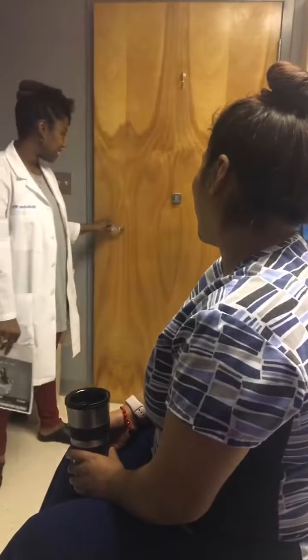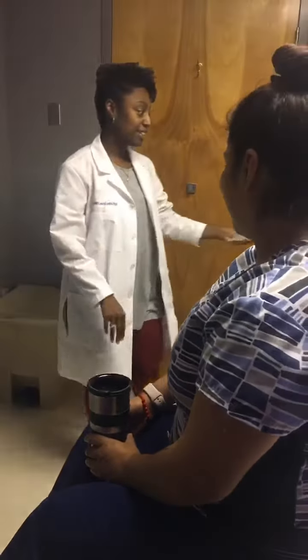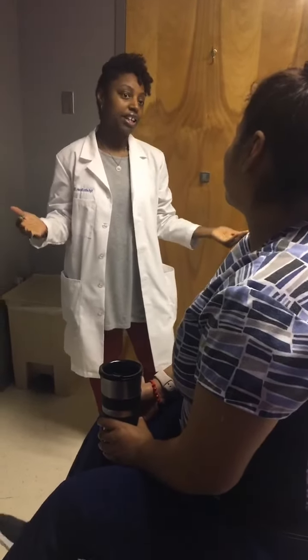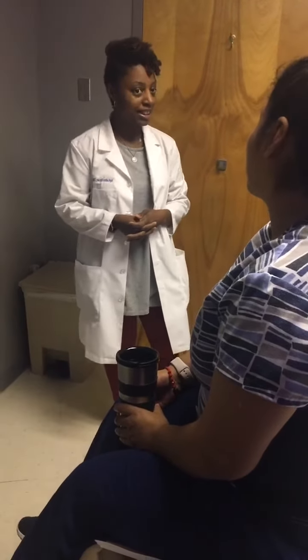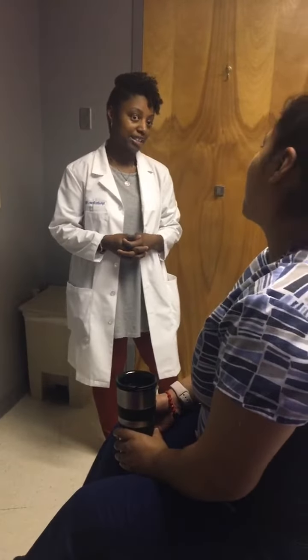Good afternoon, Ms. Janet. How are you? I'm doing great. I am Nykedra. I am actually the provider that's here seeing you today, but we are checking your blood pressure because your blood pressure has not been doing the best and we want to make sure that we actually stay on top of your blood pressure. How's that sound?